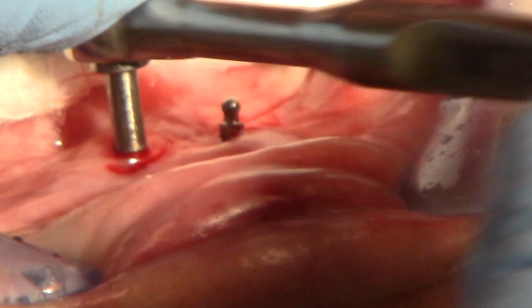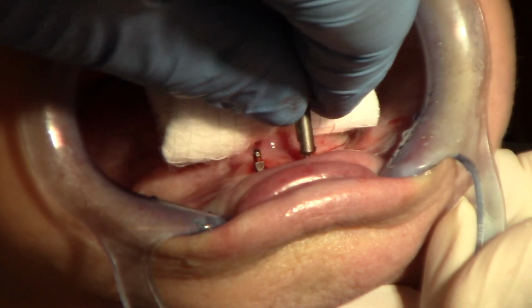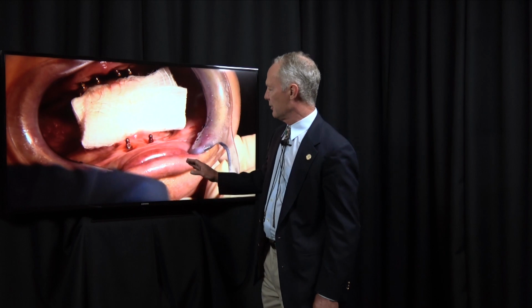There are no nerves I'm worried about. Now in this case, I'm using the ratchet wrench just because vertical dimension wasn't a problem. I didn't have enough room to use the winged wrench. Let's talk about mental nerve identification.